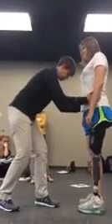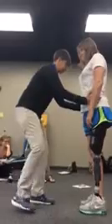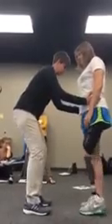So I'm going to get her going. I'm going to put my hands here, and I'm just going to walk with you. I'm not going to get in your way. Go ahead. And I'm going to see where my hands go. You can walk faster. I'll get out of the way. I promise. Right? You see what? I'm not sure if it's you or me that's a problem. All right. I don't know if you guys can see that. Watch my right hand.